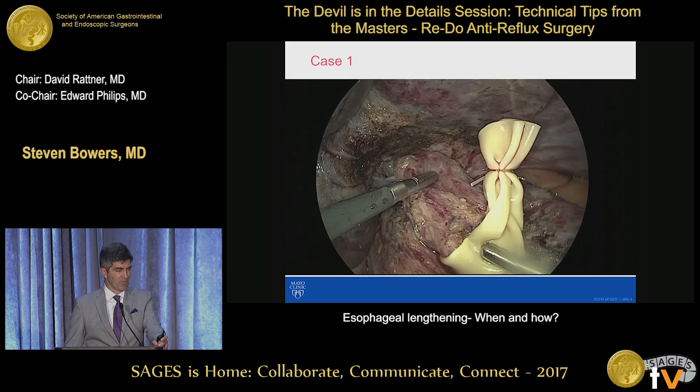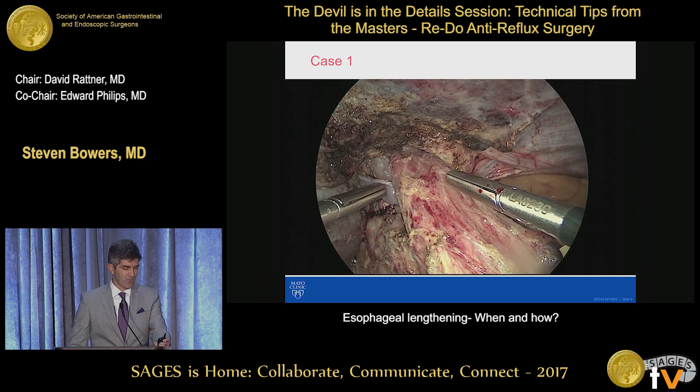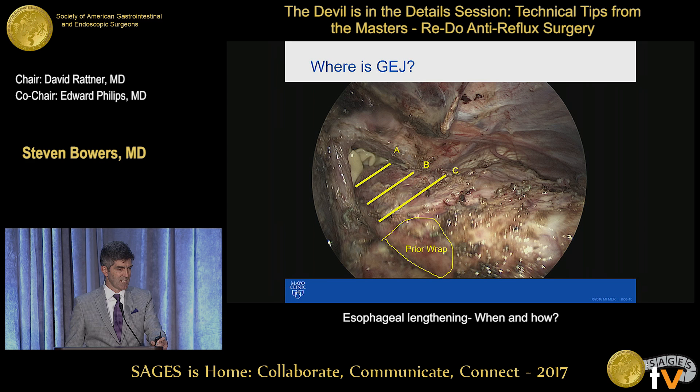So then we take the wrap down. We do intraoperative endoscopy, and that light was where the GE junction actually was. So once we've taken the fundus down, we can see that we have about a centimeter of true esophagus in the abdomen. We do that with intraoperative endoscopy. On the multi-redo setting, it's a little harder to actually identify the GE junction externally, so we use endoscopy to help us. And we can see where our prior Ethibonds were — that's where our prior wrap was. So where is the actual true GE junction? It turns out it was at A — it was a very foreshortened esophagus.